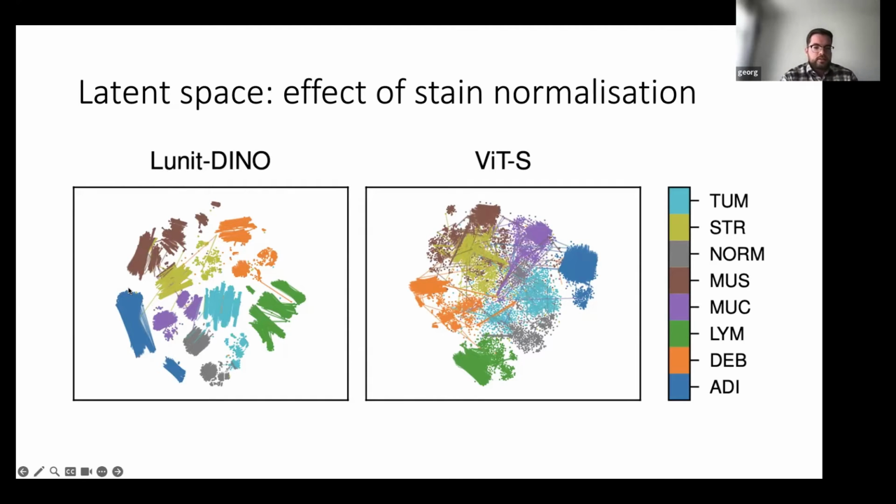And this visualization is a t-SNE dimensionality reduced version of the latent space. So every point in here is a point in the latent space.